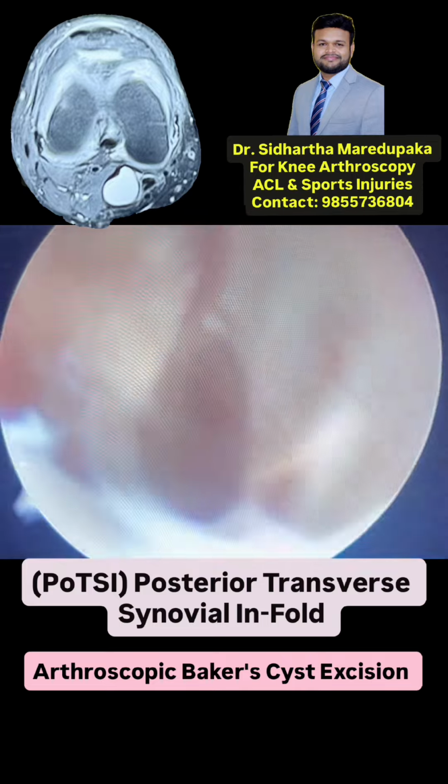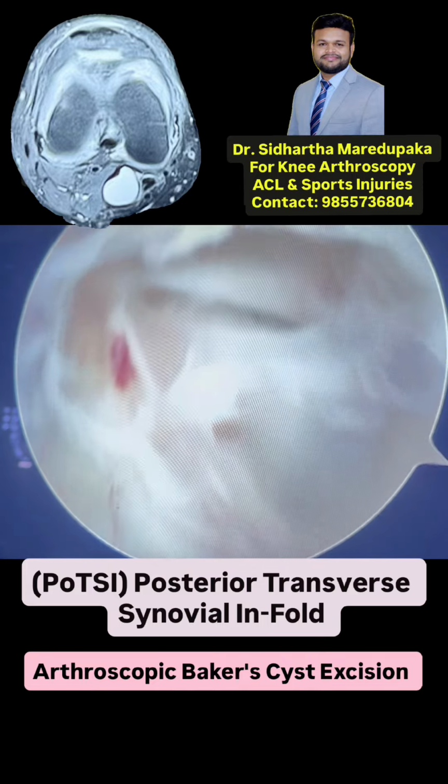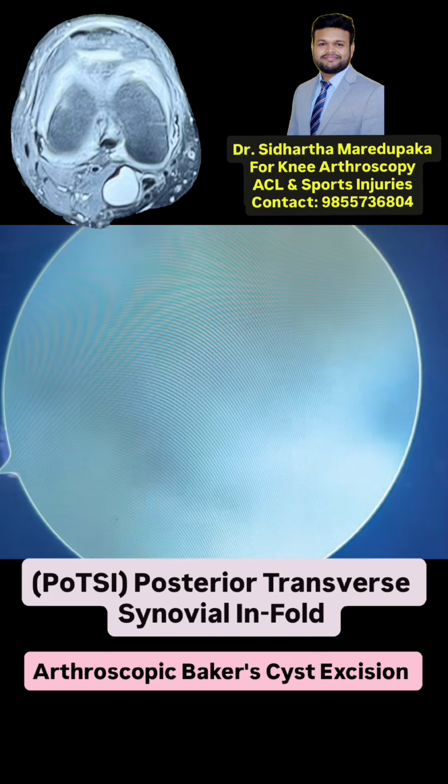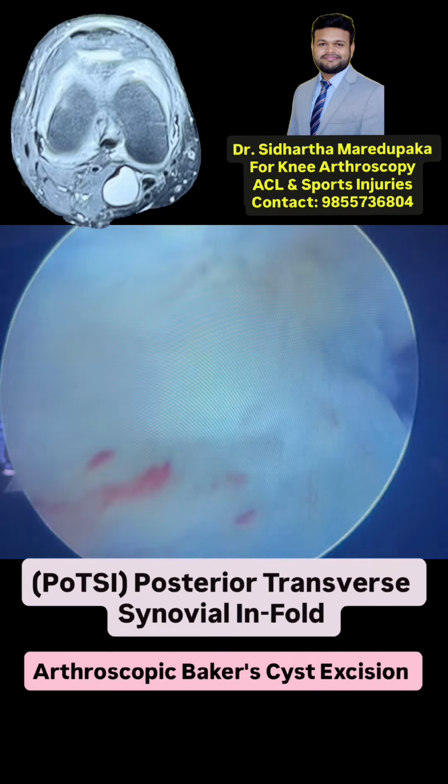Look at all the internal septations within the cyst. All these are called internal septations within the cyst. Okay. So how did I go there? I'll come back and show you.